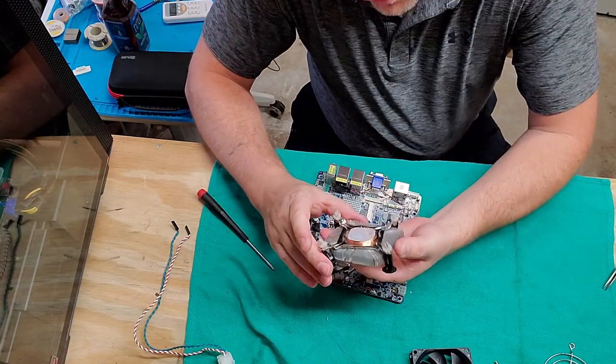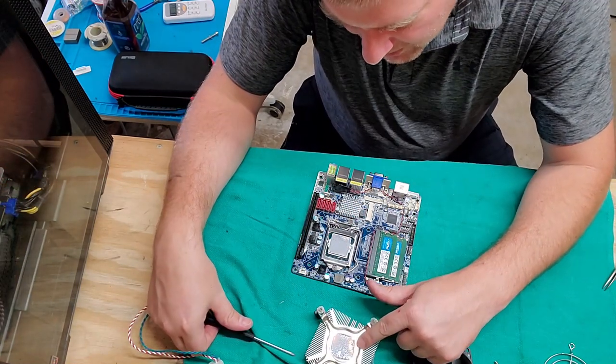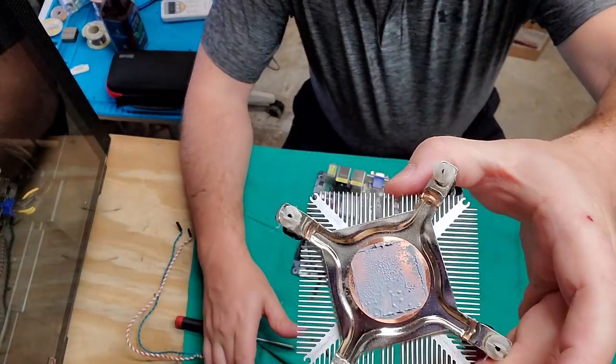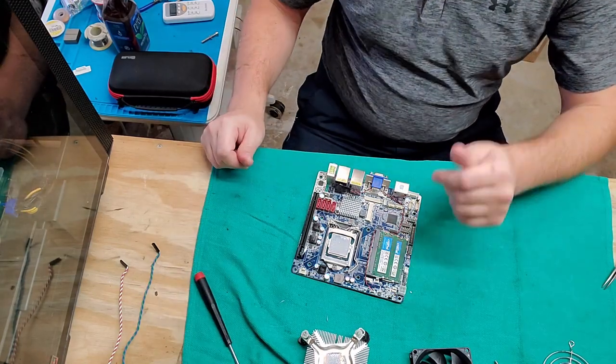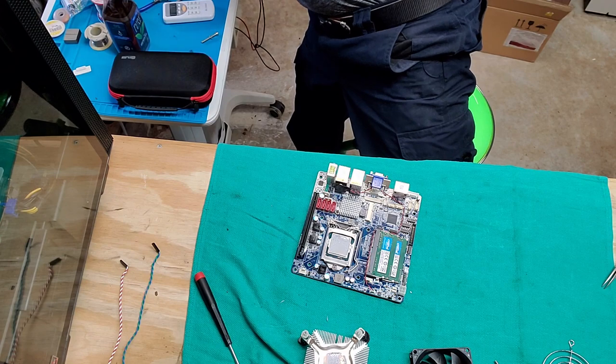Oh, cool. Despite how old this guy might be, the thermal compound right here is still liquidy. And check that out. I'm very surprised it's not a complete biscuit right there. Let me get some cleaning wipes.